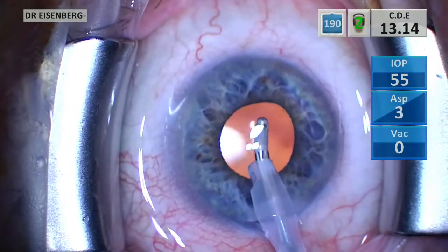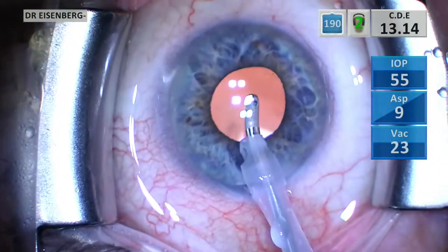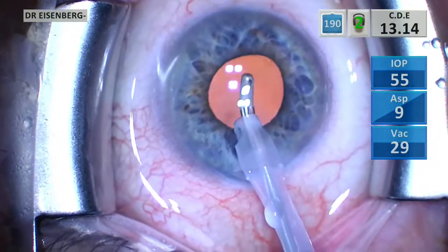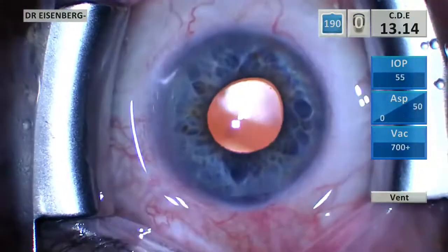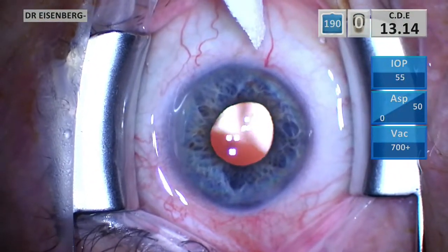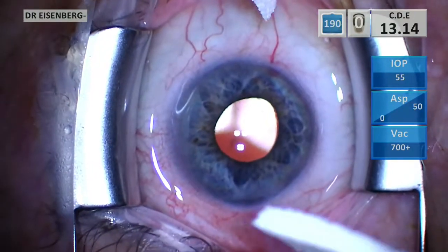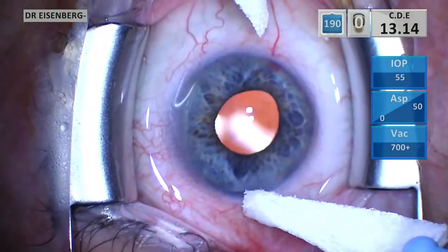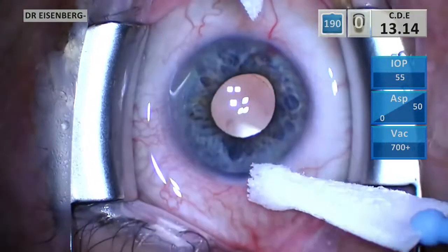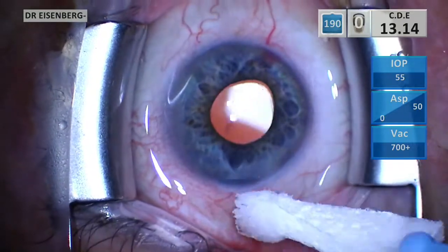Watch what happens to the perforating vein here — it's gone because it's mostly being filled with BSS now. Whereas the scleral vein on the other side is still there; it's draining a different system. And when I take it out, look at that — it fills right back up. There was another vein there next to the scleral vein that came back as well. We've got some really great flow from these two devices, and I expect excellent performance out of this implantation.